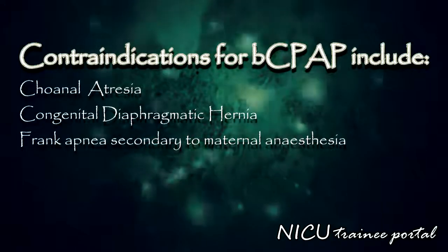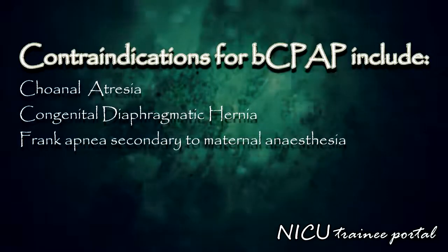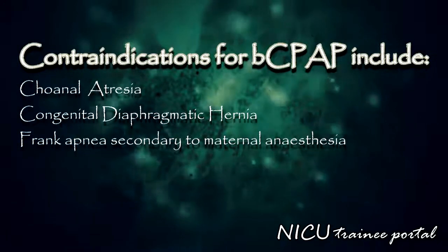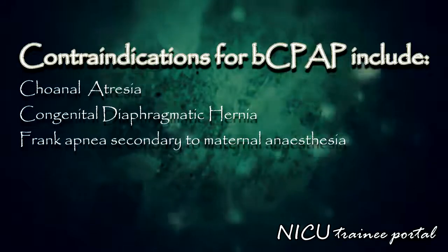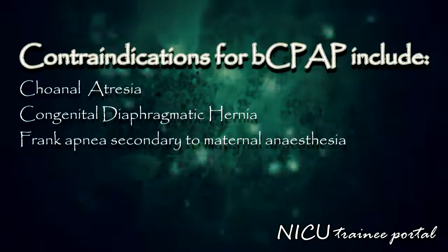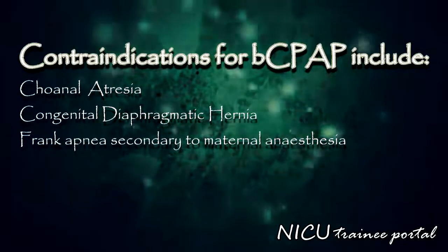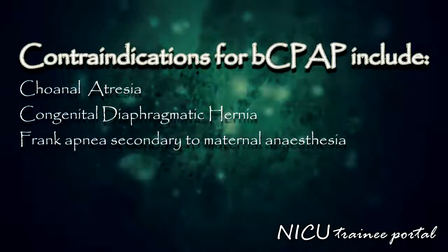Contraindications to bubble CPAP may include infants with choanal atresia, congenital diaphragmatic hernia, or depressed infants with frank apnea secondary to maternal anesthesia. A relative contraindication would include an infant with significant apnea of prematurity who requires a higher degree of support, such as nasal intermittent positive pressure ventilation.